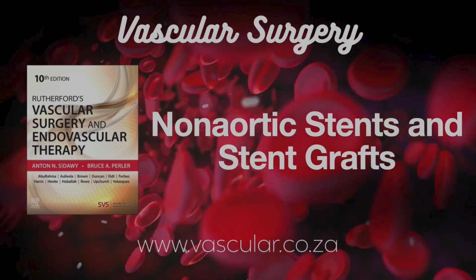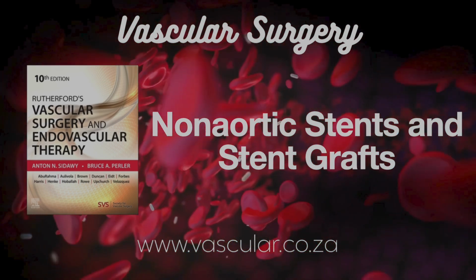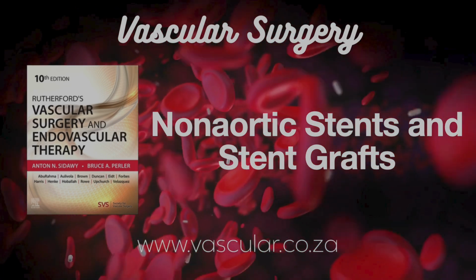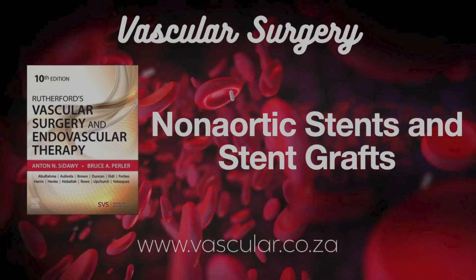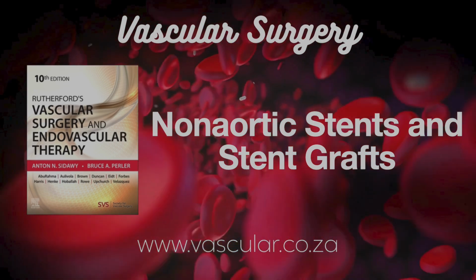Is endovascular catching up to surgery for these big iliac blockages? It seems like it. Modern techniques, including covered SE stents going right down into the top of the thigh, are showing pretty good long-term results now, challenging the traditional surgical approach. What about below the groin, infrainguinal arteries? Generally SE stents territory down there, except for the common femoral artery right at the groin crease.